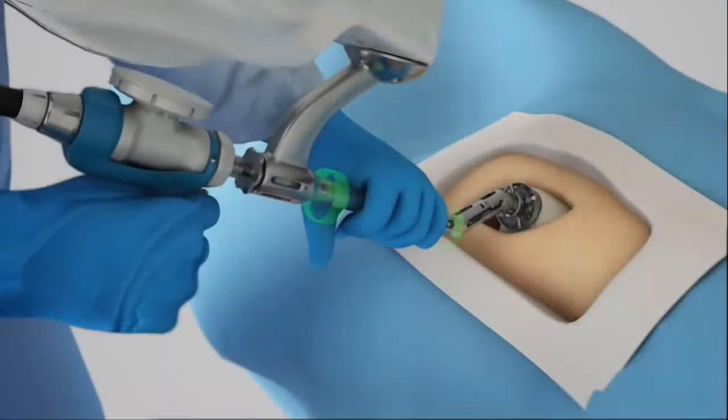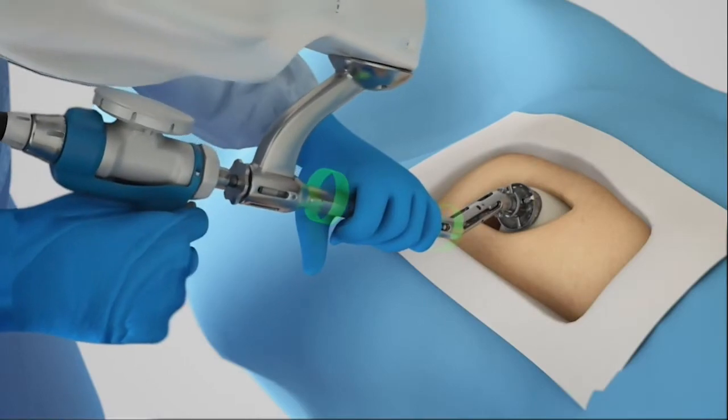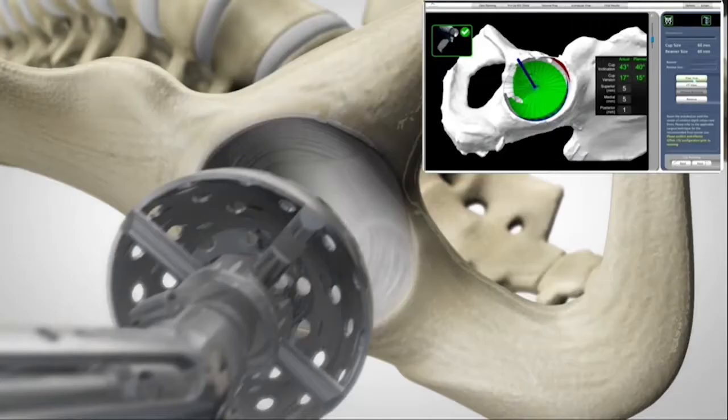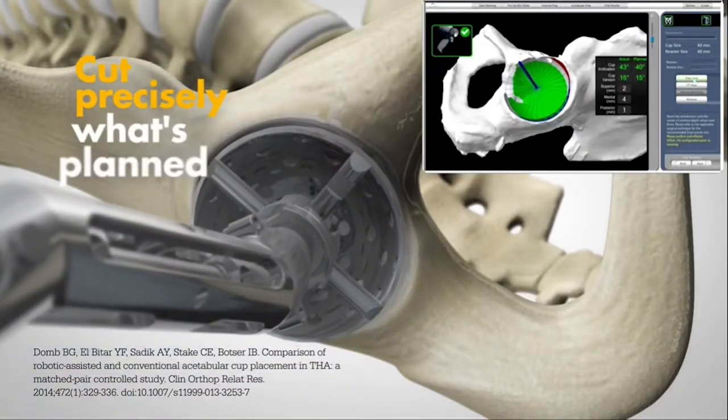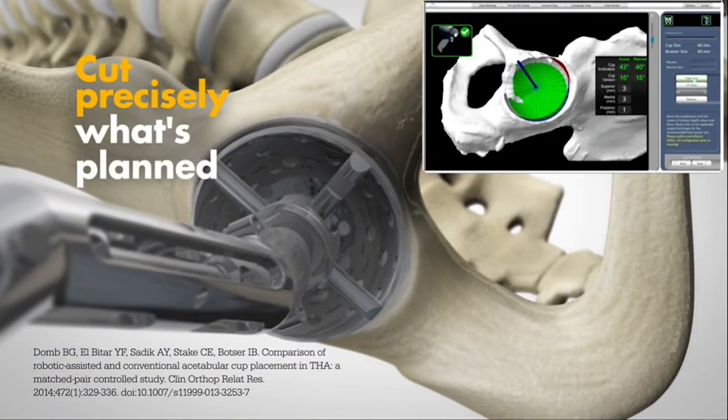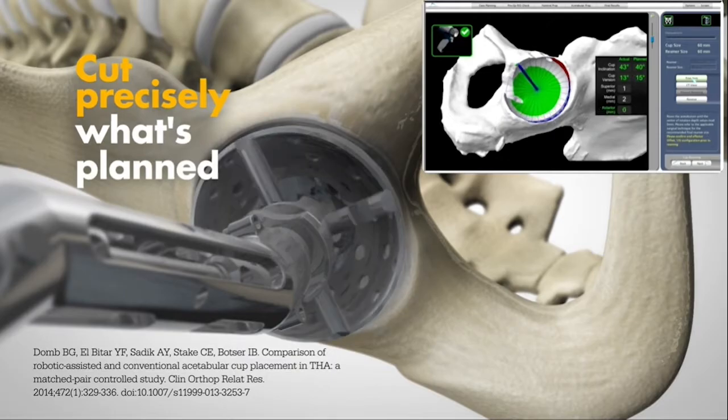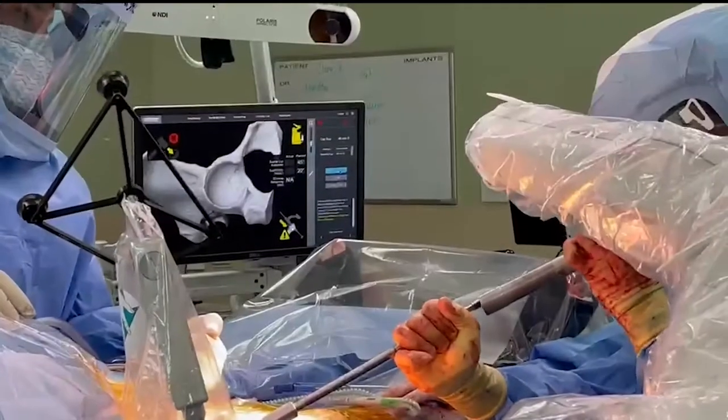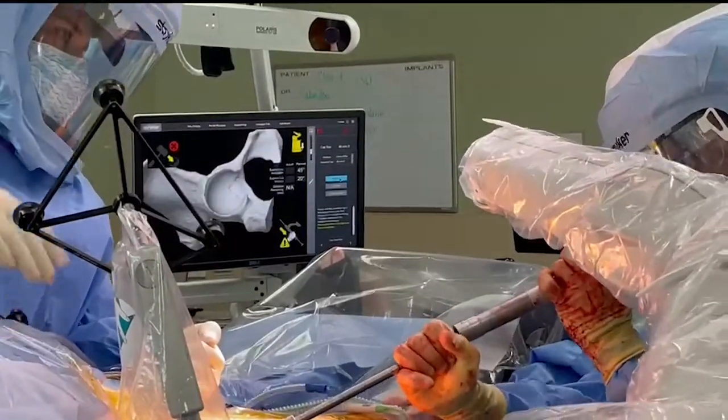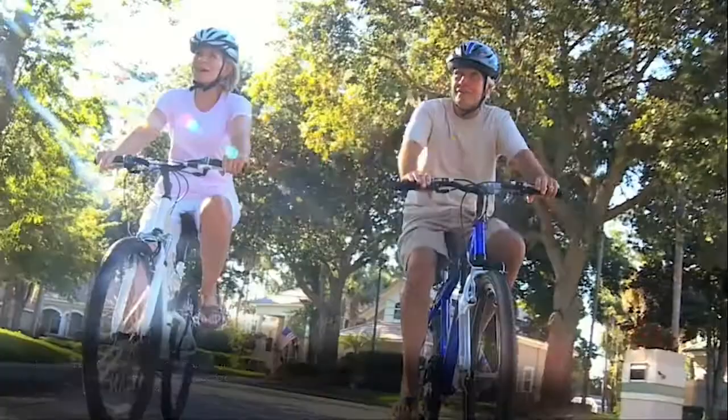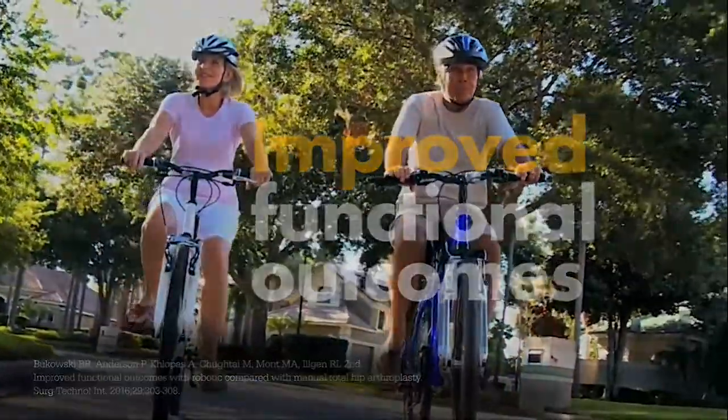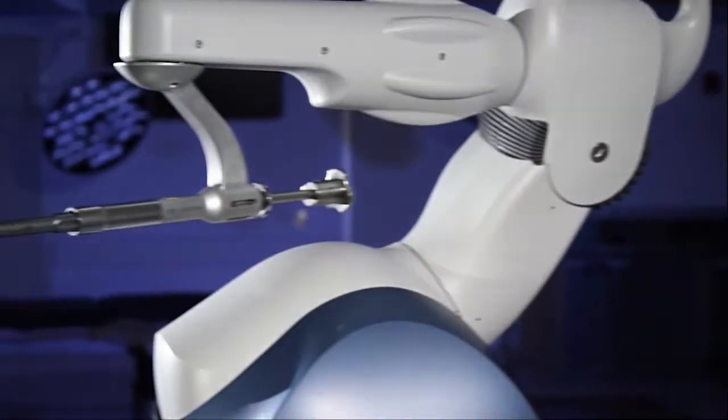Imagine executing your plan with AccuStop haptic technology to cut precisely what's planned. Imagine the power to preserve healthy bone and improve functional outcomes. You don't have to imagine it anymore.